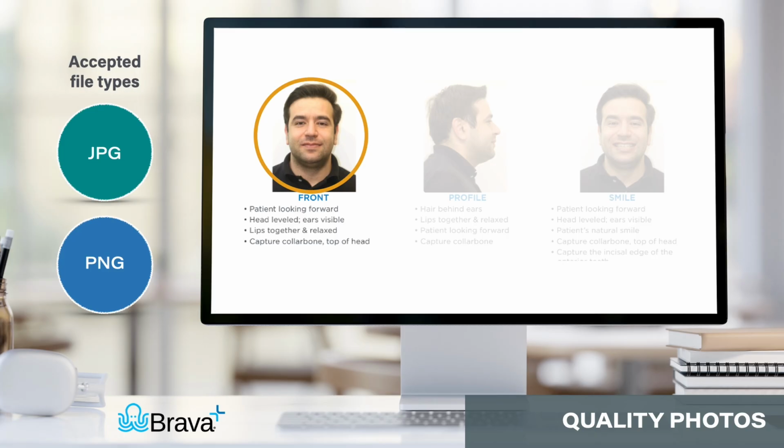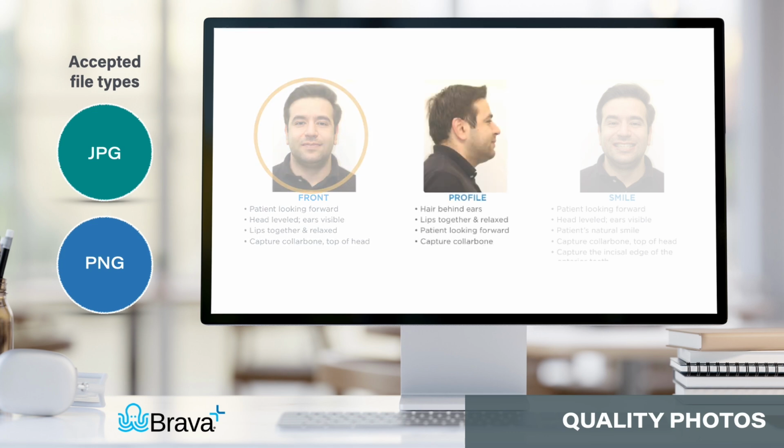For the front photo, make sure the patient looks forward, head leveled, ears visible, lips together and relaxed, and capture from collarbone to the top of the head. For the profile, make sure the hair is behind the ears, lips are together and relaxed. Patient is looking forward and photo is captured from the collarbone to top of head.